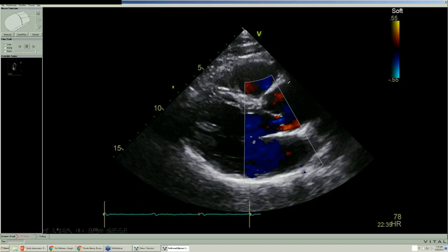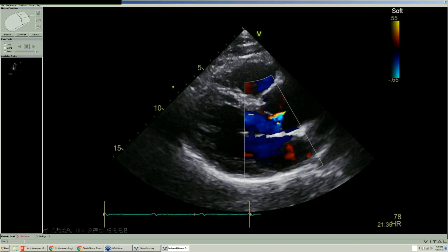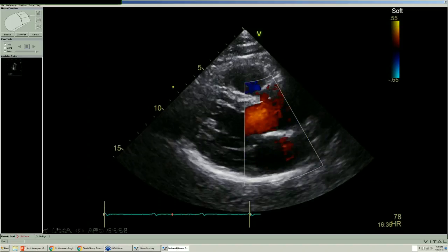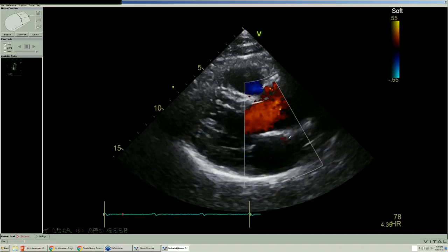And then we can measure, say, from internal diameter. In this particular site, internal diameter is 53. We can get different measurements on this, and obviously it would be nice to have some kind of standardized measurement, which we will show you in a minute. And there's the leakage of the aortic valve right there, very slight. So we'll talk about what that means in a minute in terms of repair.